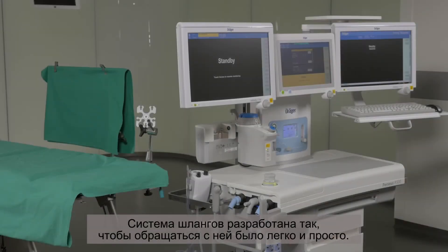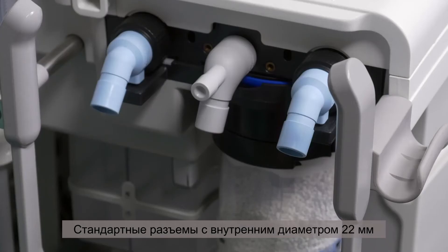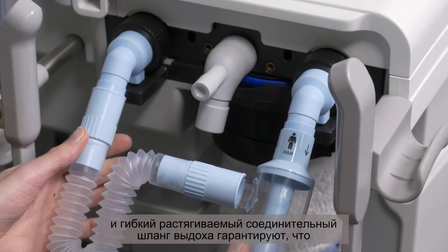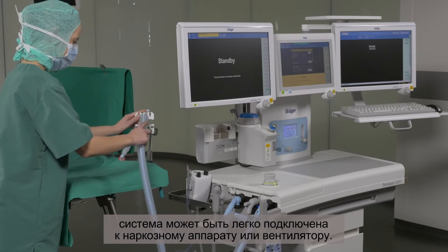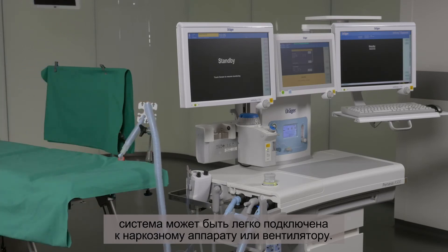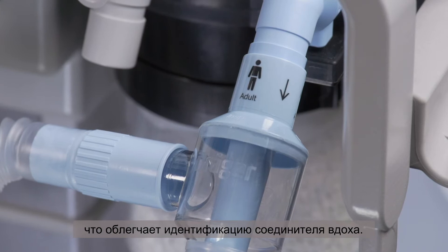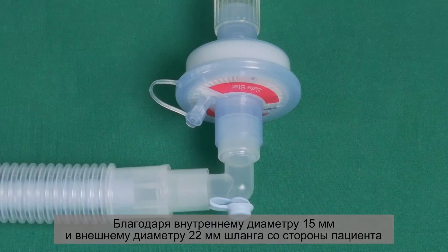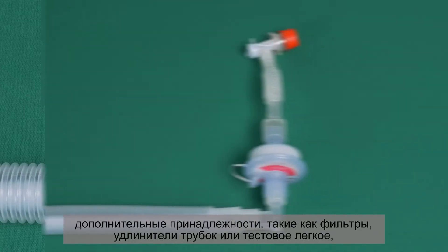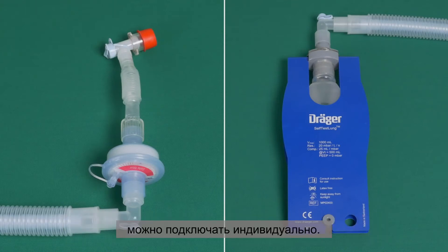The hose system is designed for easy and uncomplicated handling. The standard connectors with an inner diameter of 22 millimeters and the flexible extendable expiratory connection hose ensure that the system can be easily connected to an anesthesia or ventilation system. The arrow indicates the gas flow toward the patient and makes it easy to identify the inspiratory connector. Thanks to the inner diameter of 15 millimeters and the outer diameter of 22 millimeters on the patient side of the hose, additional accessories such as filters, tube extensions, or a test lung can be connected individually.